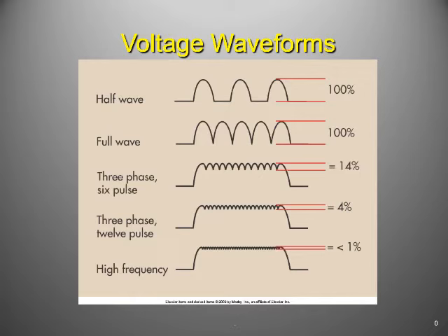When that diode went out, it's like 2 diodes went out. And so I've just lost that 3-phase part. I just have 1 phase, 2 pulses. What is 1 phase, 2 pulses? This right here. 1 phase, 2 pulse is full wave rectification, 100% ripple.